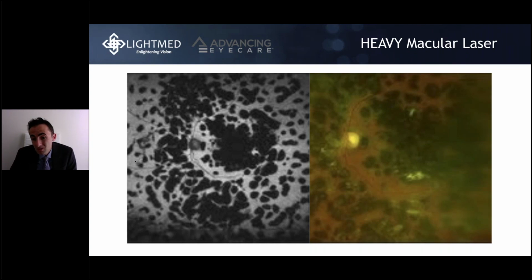And most recently, if you have a patient who you think might have a macular hole, or they do have a macular hole, and you're not sure if vitrectomy with inner limiting membrane peel alone will close the hole, I like to leave a triangle in the nasal periphery, if possible, without laser treatment, because you never know, you might need to borrow that piece of neurosensory retina and do a transplant to fill in the defect of the macular hole in some part of the macula in the future.